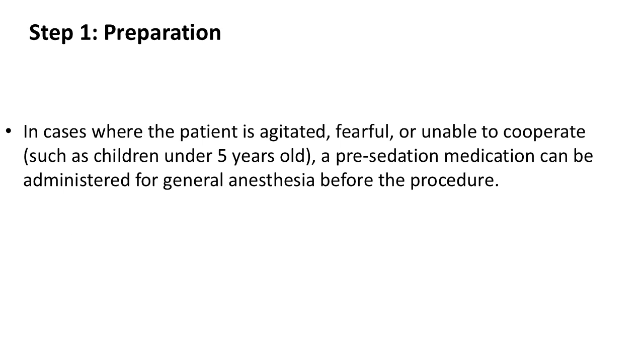In cases where the patient is agitated, fearful, or unable to cooperate, such as children under 5 years old, a premedication can be administered for general anesthesia before the procedure.